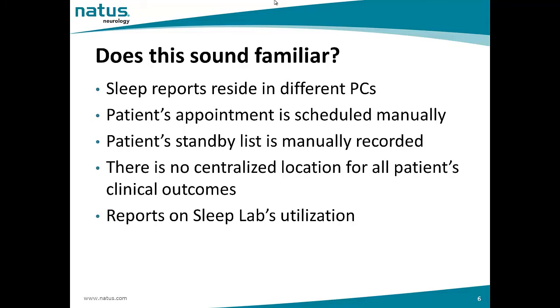That sleep reports reside in different PCs. Patient's appointment is normally scheduled manually or by Excel file. Patient standby list is also manually recorded. There is no centralized location for all the patient's clinical outcomes, meaning you don't have a centralized location where you can just find all your patient's reports or AHI.